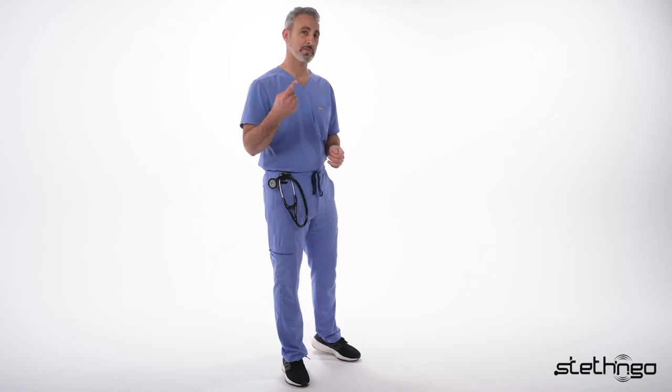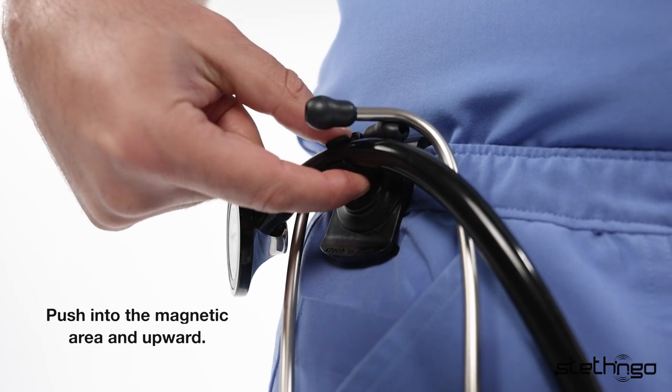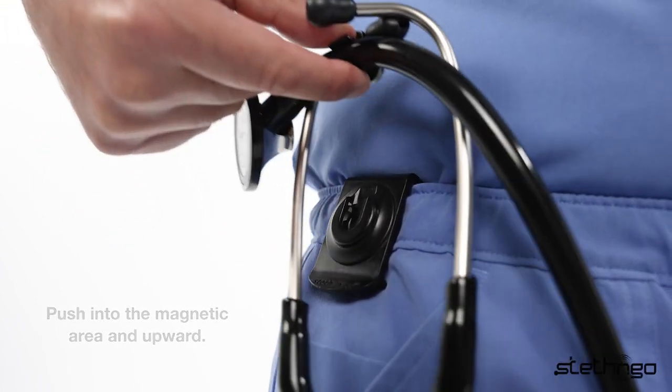Now for the detachment, all you have to do is use one finger. You're going to place it right underneath, push into the magnetic area and upward, and it's that easy.